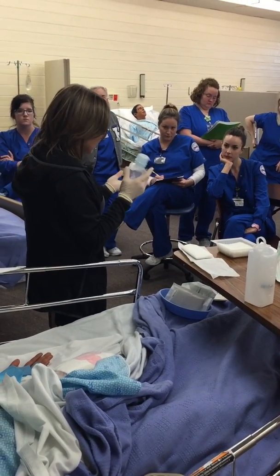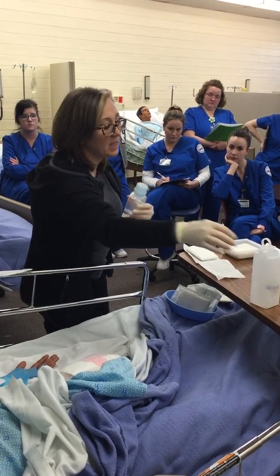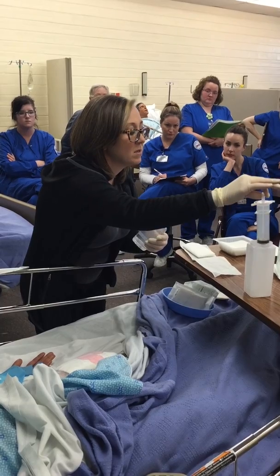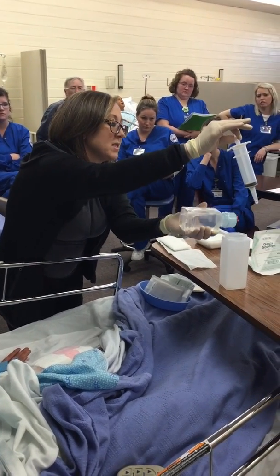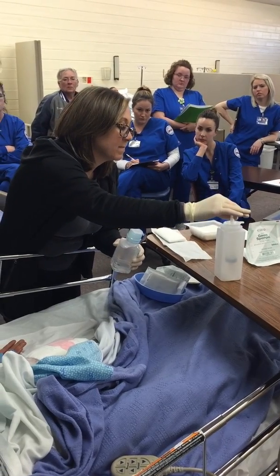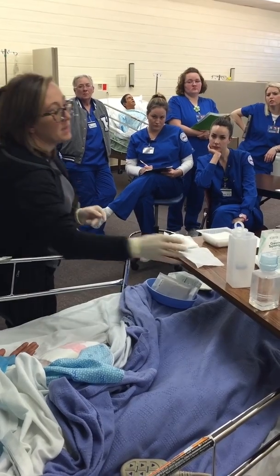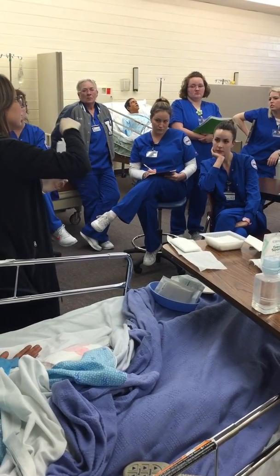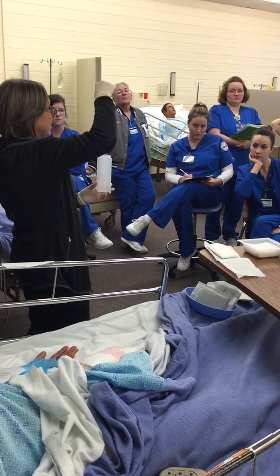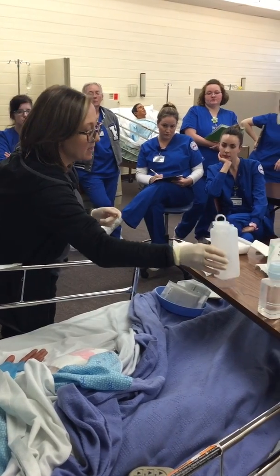Do I have to have gloves on to do this? No. I'm going to check the expiration date, I'm going to lip it, and I'm going to put saline in here. And so I'm going to lift this straight out, and I'm going to put this in like this, and I'm going to put this straight back in. Why do I do it like that? So it stays sterile. Because this is not sterile, and this is not sterile, but everything inside that container is sterile. Okay? So it goes straight in there. Right? So I've got my saline in there.